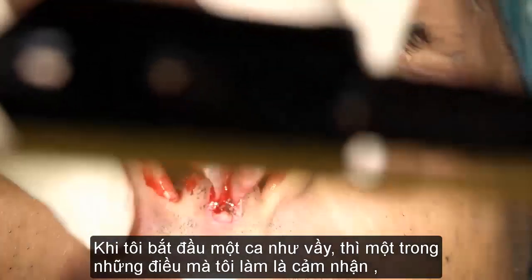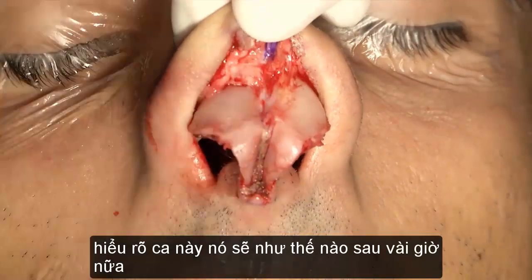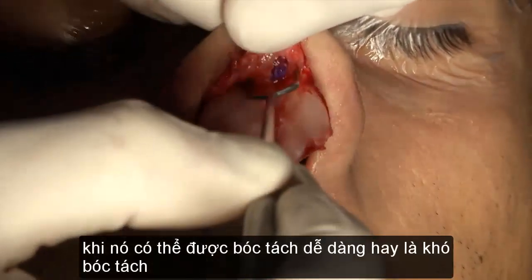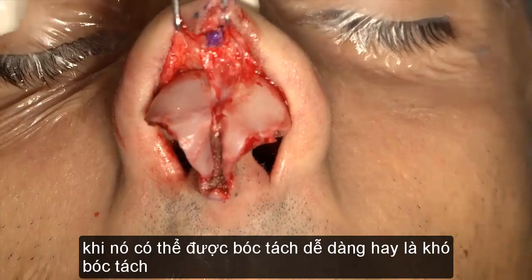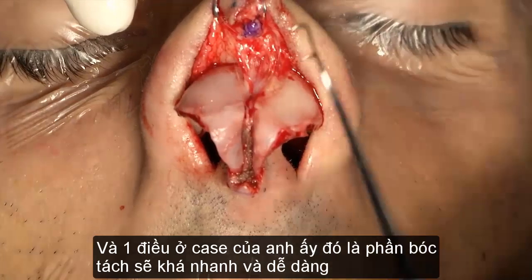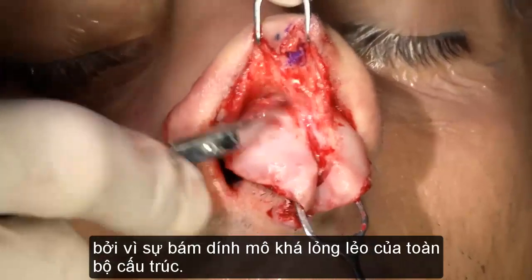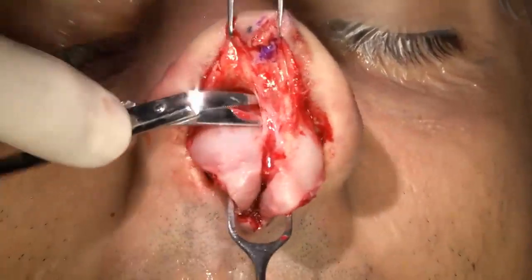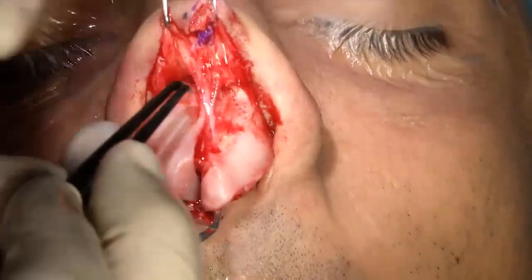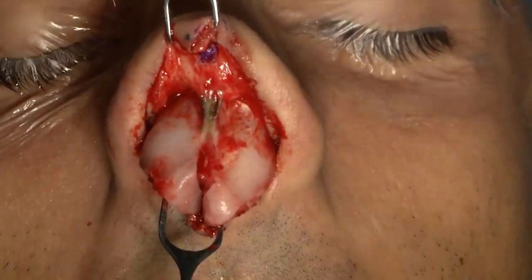So when I start a case like this, one of the first things I do is I take a feel, meaning I can actually, give me the big hook, understand what this case is going to mean for me in the next hours, since it may be that it dissects easily or that it does not dissect easily. And in his case, give me the scissors, I can see that his dissection is going to be quick and easy, since there's a very flimsy attachment, don't pull like that, of all these structures. So it's simple for me to just deal with them.